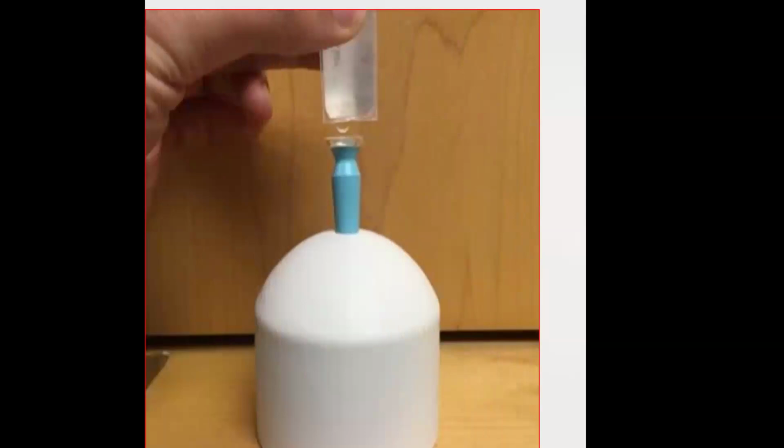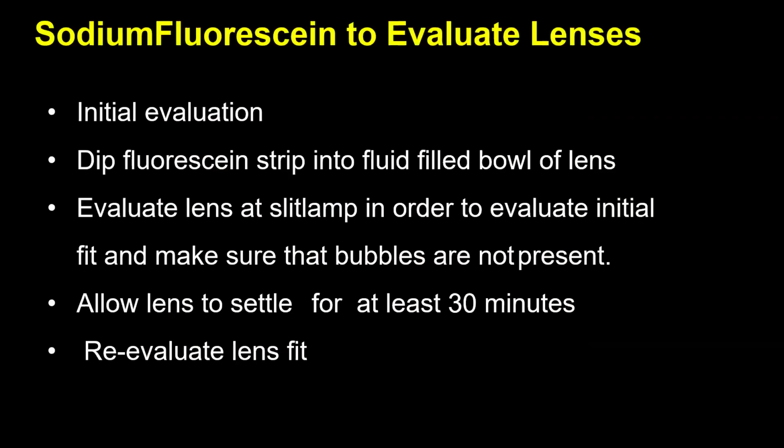So this is also another holder. You see the solution being put on the lens holder. You can bend your face and fit the lens.